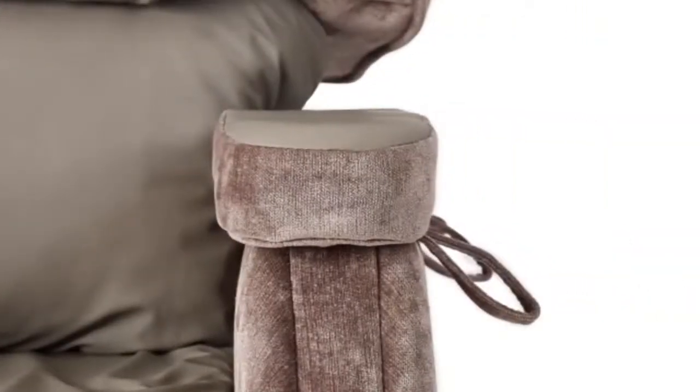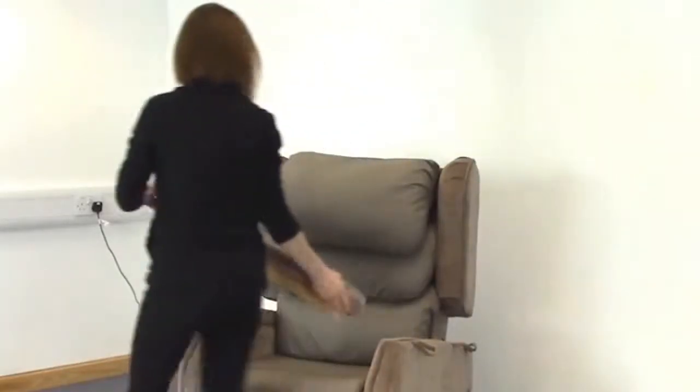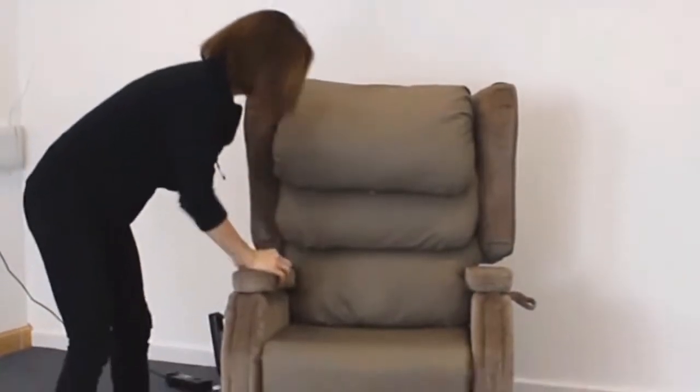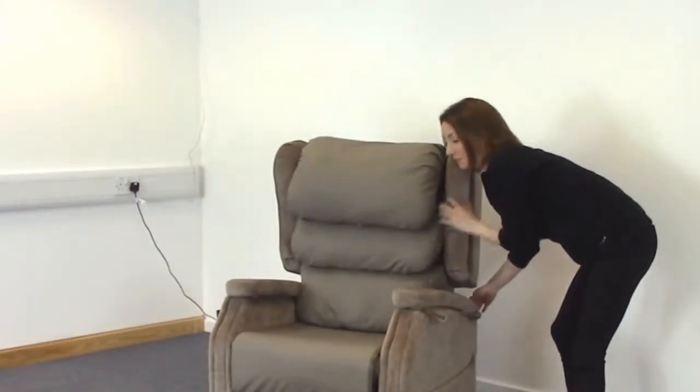The actual seat width cannot be adjusted; however, what we can do is switch the armrests over to ensure that the overhang is on the inside. That brings the armrest a little bit nearer to provide more support when pushing up for the transfer. To do that, we undo the screw at the back, push the armrest back, and lift it out of place. Do the same on the other side and put them into the opposite side. Tighten up the screws at the back and you can see that the overhang is on the inside, bringing the armrest that little bit closer.